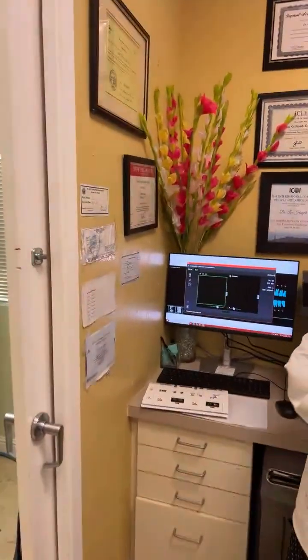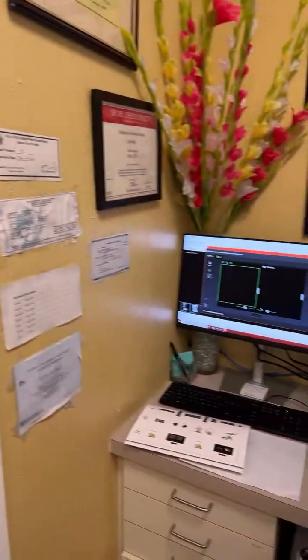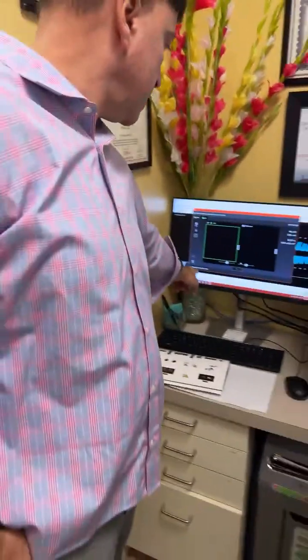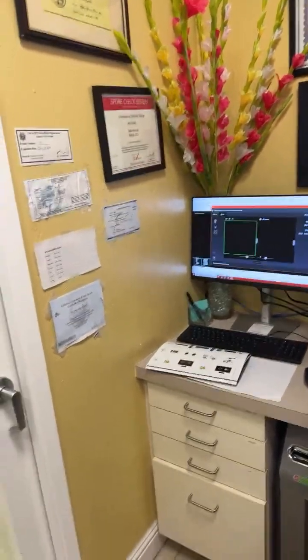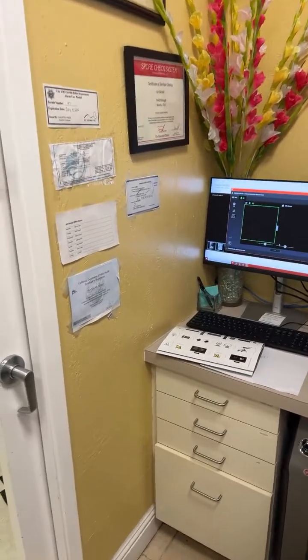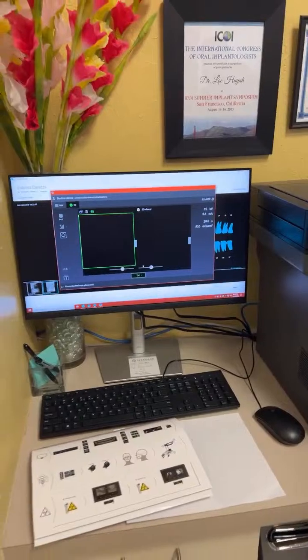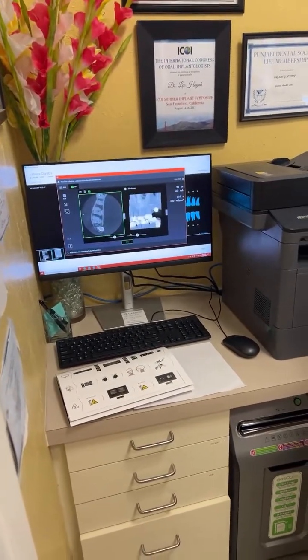Now you can release your patient. Not bad. That was the highest resolution with the smallest field. I think it might be good to sit down. It's a lot better to sit down. That takes a long time. That's the longest scan because of the resolution it chose. So that should be fine. How many seconds to wait? That's 20 seconds there. Okay.